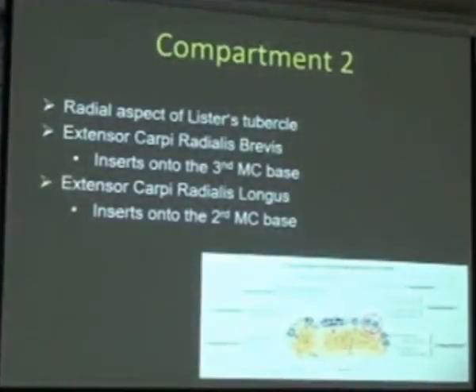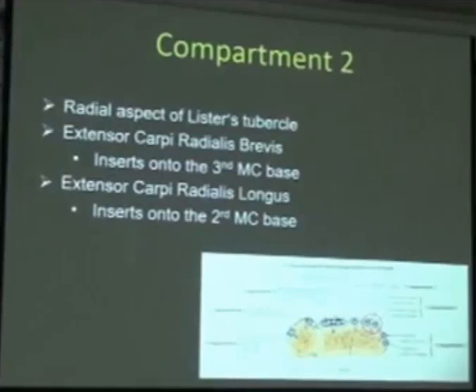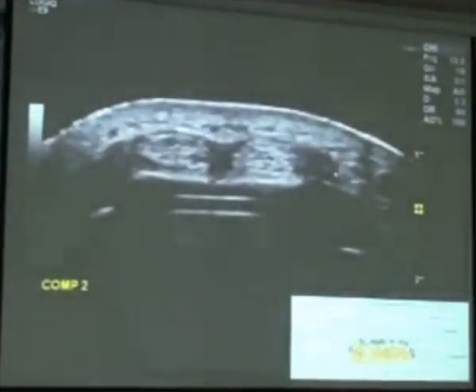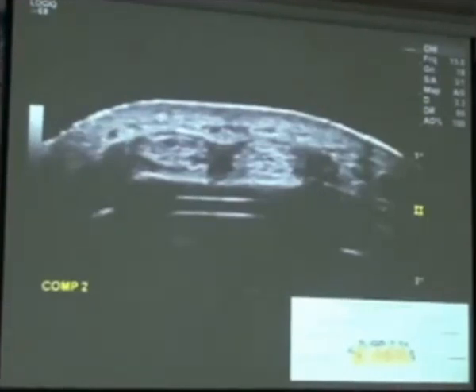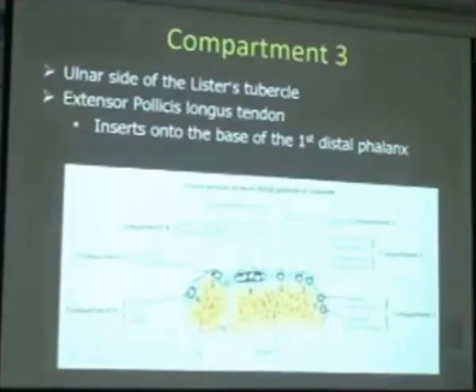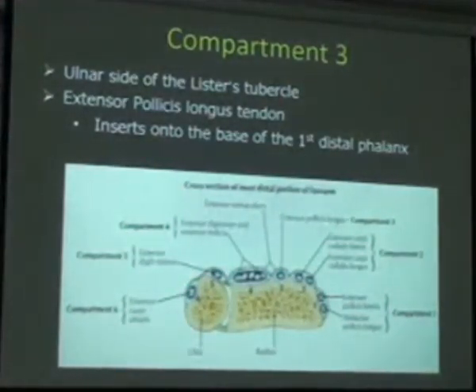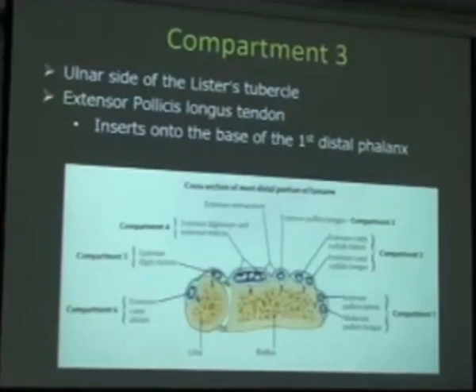Moving a little more dorsally, we come to compartment two, which houses the extensor carpi radialis brevis and extensor carpi radialis longus tendons. These are the two tendons here — compartment one is over here, and you can see the nice round tendons in transverse with the extensor retinaculum going over the top. The next one across is compartment three, which houses the extensor pollicis longus, and this extends down onto the base of the thumb's distal phalanx.